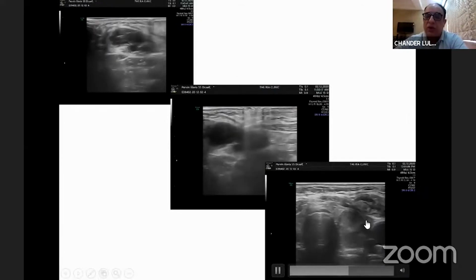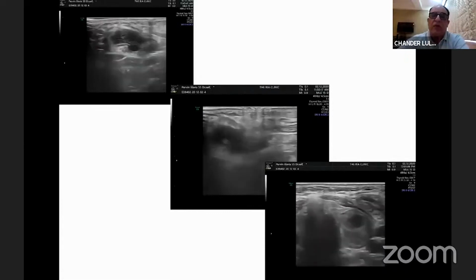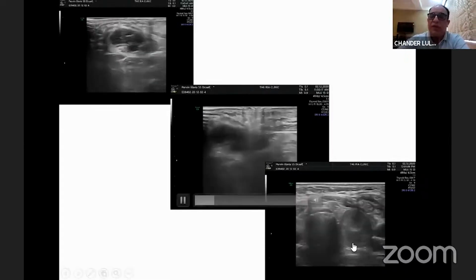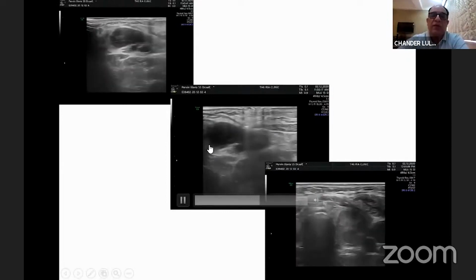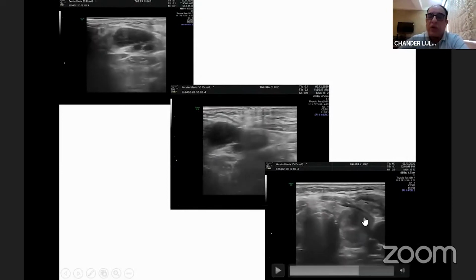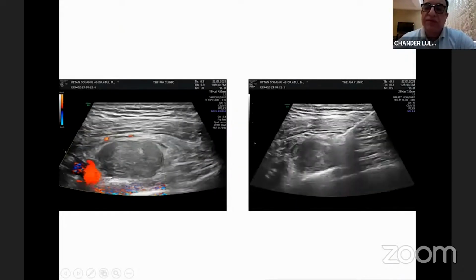And that's the gun which goes in and takes a true cut biopsy and comes out. So that's a true cut biopsy. That's an FNA. That's the gun here, which shoots and takes a biopsy. More preferred for lymph nodes, and for the thyroid nodule, we essentially do an FNA for the biopsy. And here is another lesion here, which is getting an FNA done.